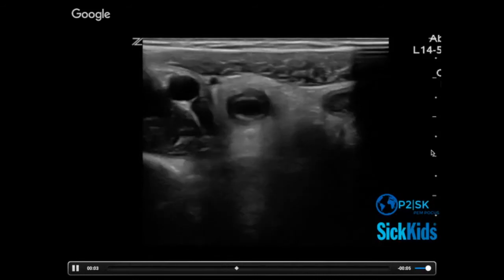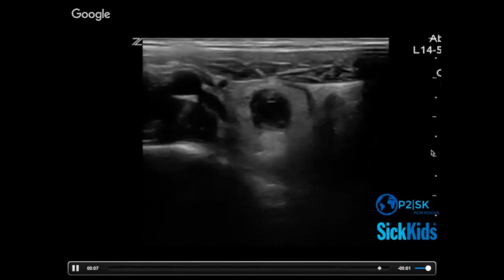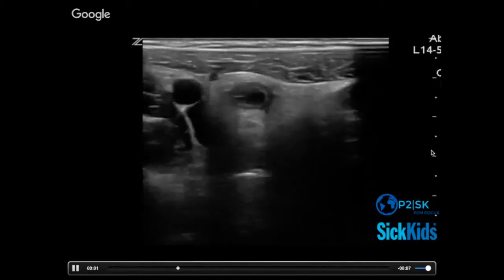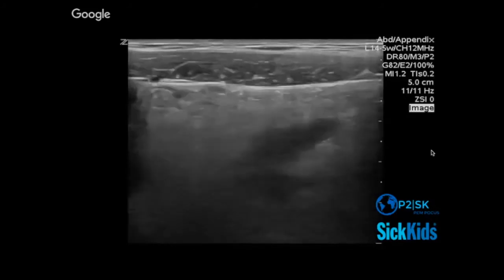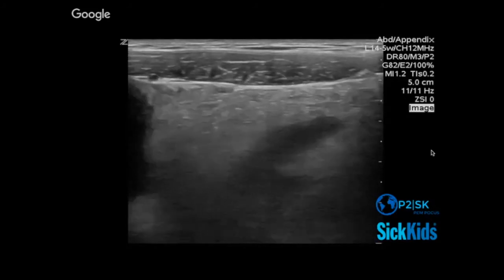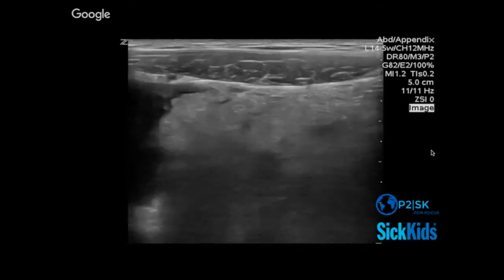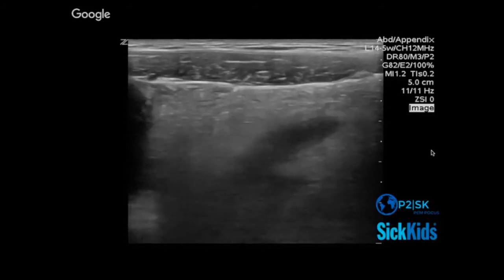And sometimes those patients can have a very impressive sonographic exam and sometimes not so much. And we're still just at the beginnings of figuring out what sonographic and history and physical and lab findings really help you separate those things.